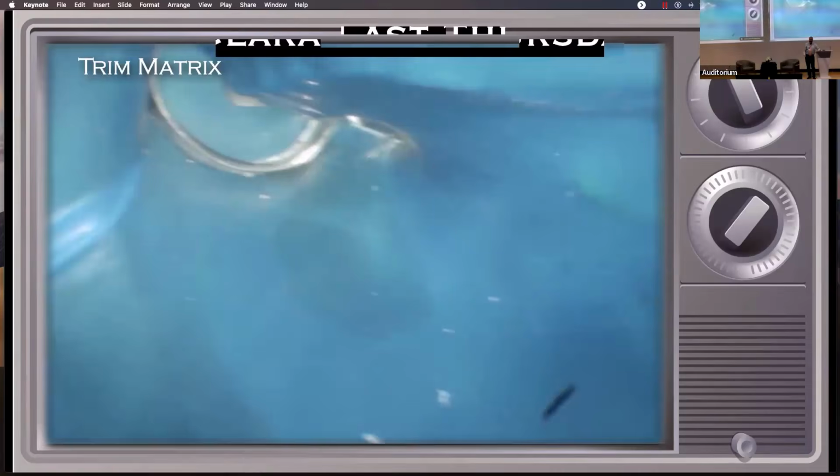Truth be told, I don't do this. I have a stock of these that are set aside with little bands on them so I know which ones are which size. So just trim them, reuse them. They'll get a little bit sticky sometimes after you've used the matrix over a few times with the sound seal. Just Vaseline up the matrix and you're fine. So that's kind of what it looks like. This is a blurred shot, sorry. But you can see the outline is kind of that long, skinny, the same orientation as the access.